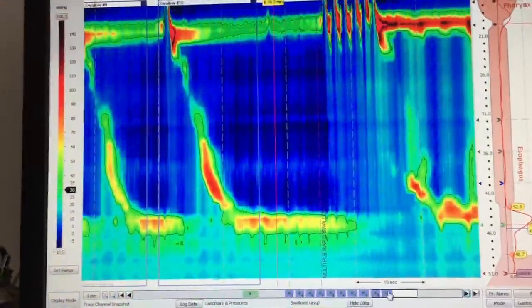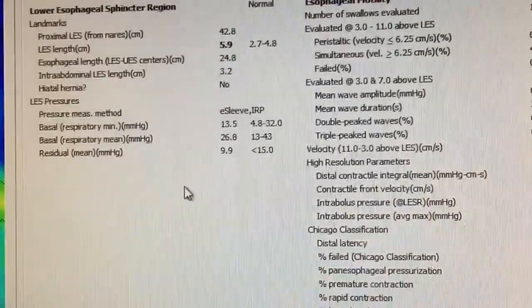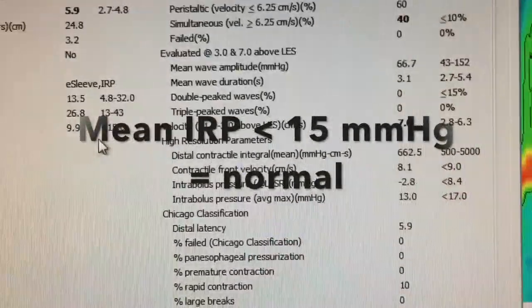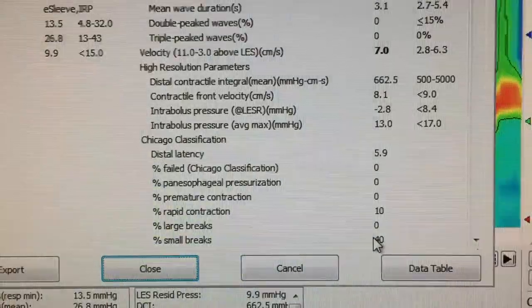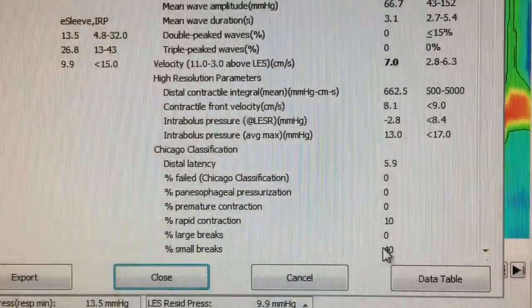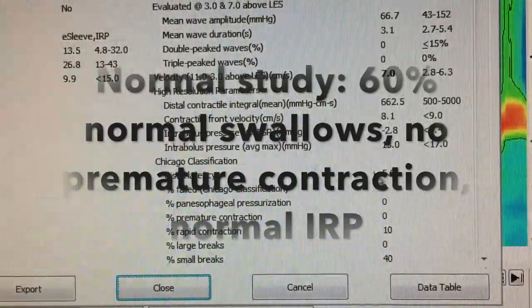We can go to the report now. If I look at the IRP, the mean IRP is around 10, which is normal. I will also look at the multiple rapid swallow.